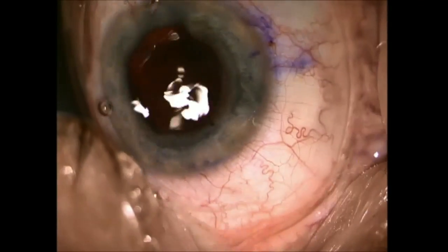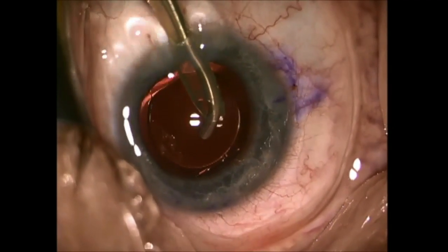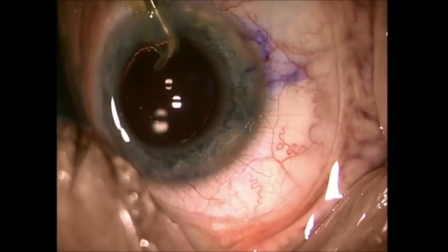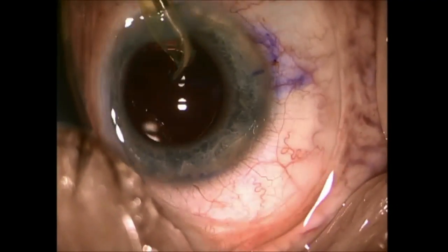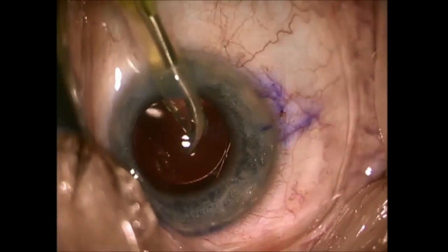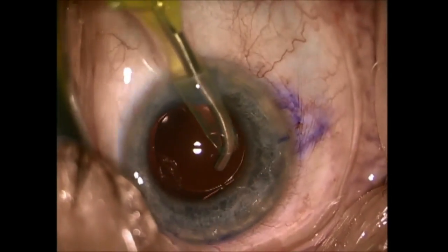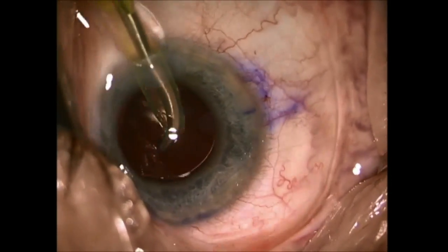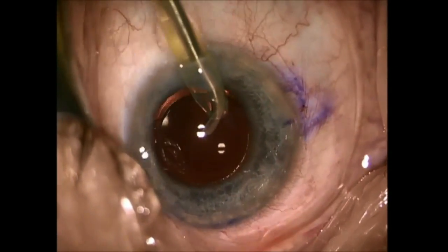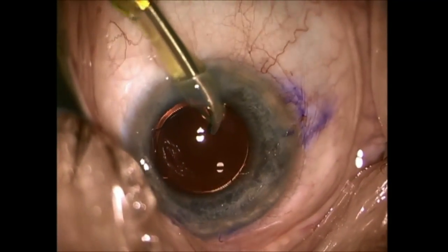Once the implant is in, the next step is complete removal of the OVD, or ophthalmic viscoelastic device. I go in and rock the implant back and forth, tap on it, and rotate it to make sure all of the OVD is out. All implants, before I seat them, whether I torque or not, I rotate using the IATIP 360 degrees to ensure complete removal of all of the OVD.